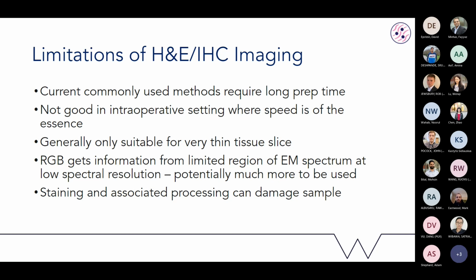But there are also options to take your information from more spectral regions and essentially transfer it into an RGB visualization via a variety of methods.